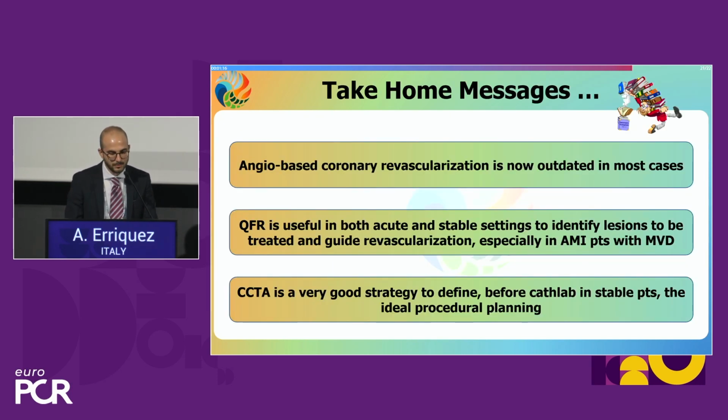So, in conclusion, my take-home messages are that nowadays an angio-based revascularization is outdated in most cases, because we have different tools available in our cath labs to achieve optimal results for our patients. And in particular, QFR is very useful in both stable and acute settings to identify lesions that need to be treated, but also to guide and optimize the revascularization.